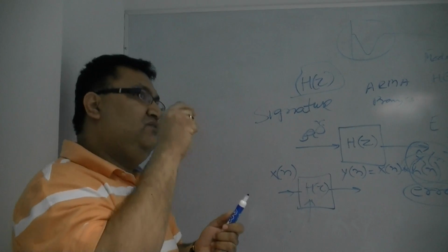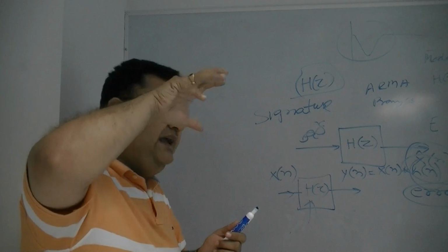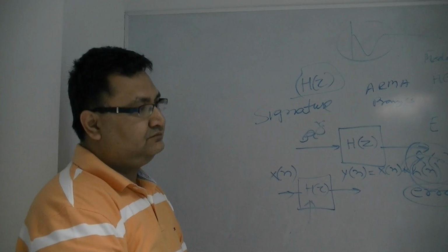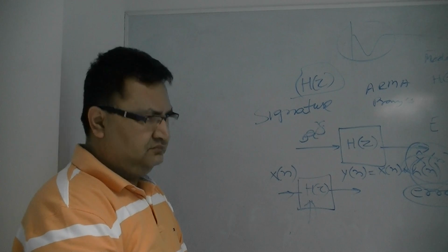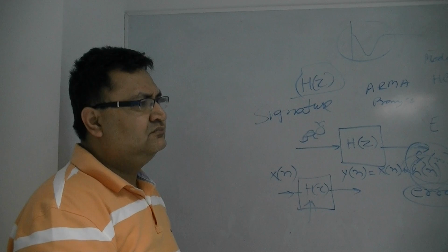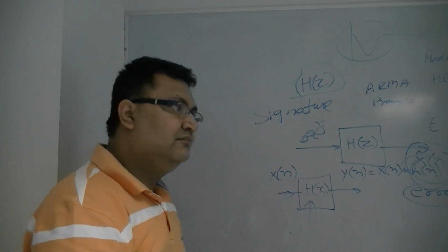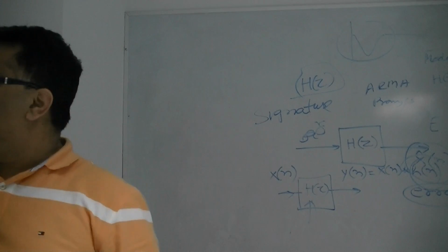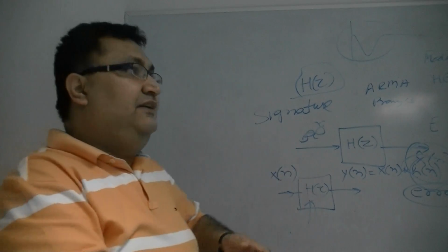My objective is, whatever we think, how it reacts with EEG. If you learn the function of the hand movement, and if you have a time series of eye movement, how do you compare them? Both will have different EEG. Both will have different kinds of voltage movement. Both will have different channels.